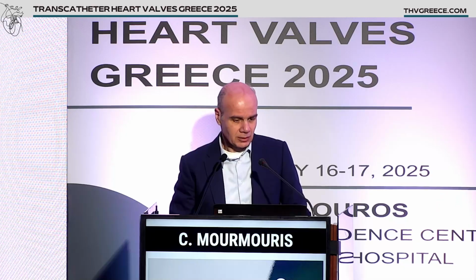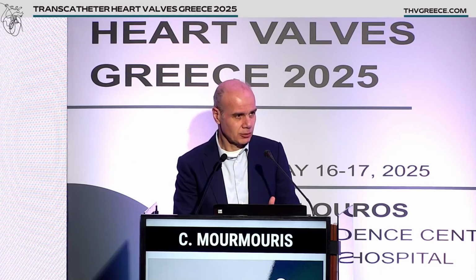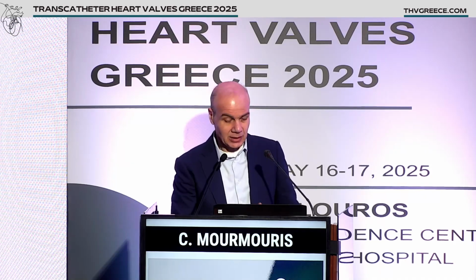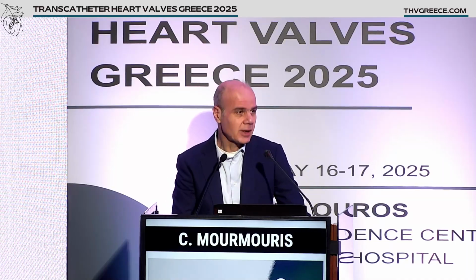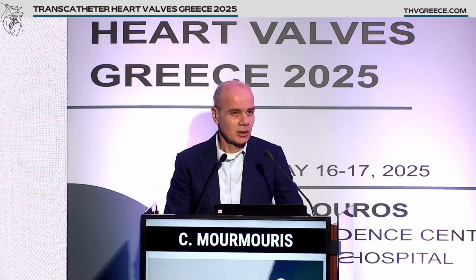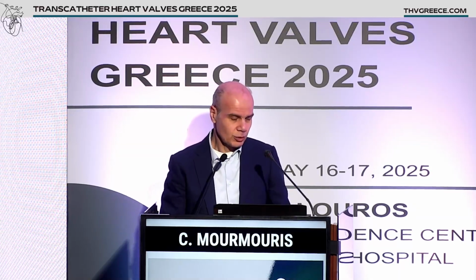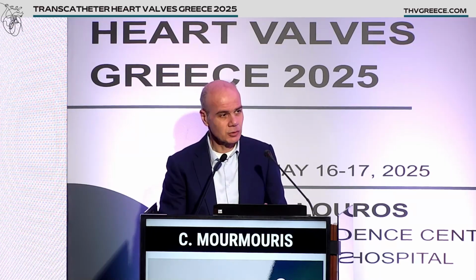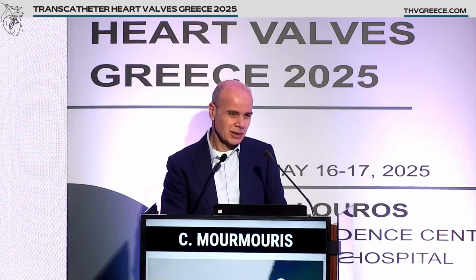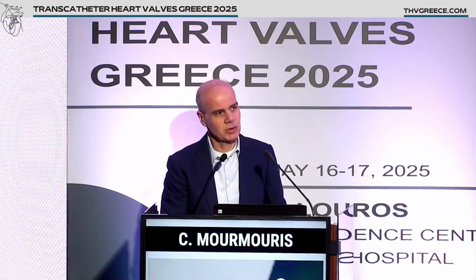First of all, in TAVI cases, we target the left ventricle, and in these cases, we mainly target the right chambers. We also want some opacification of the left ventricle, but the target chambers are quite different.